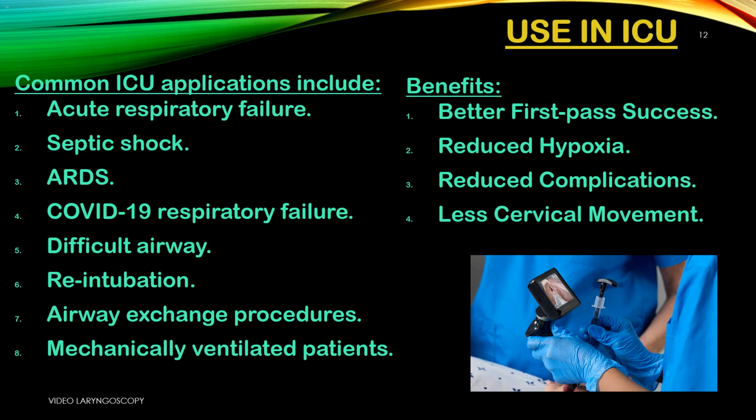3. ARDS. Lungs are very stiff and oxygen is low. First pass success helps avoid prolonged hypoxia. 4. COVID-19 respiratory failure. Reduces aerosol exposure to staff. Also helps swollen, difficult airways. 5. Difficult airway. ICU patients often have edema, secretions, or limited mouth opening.